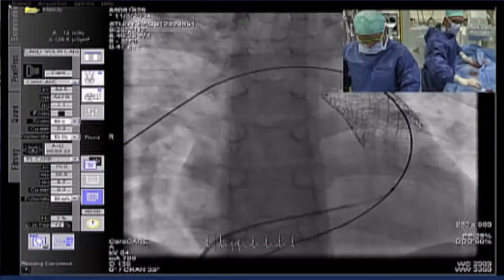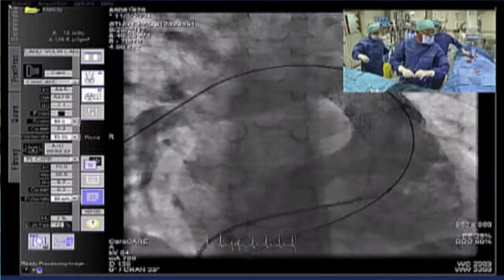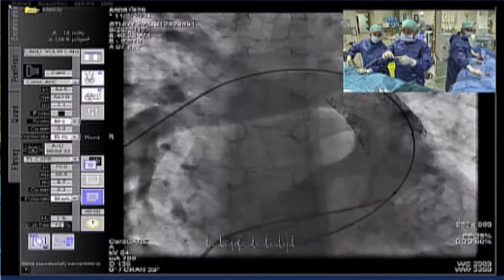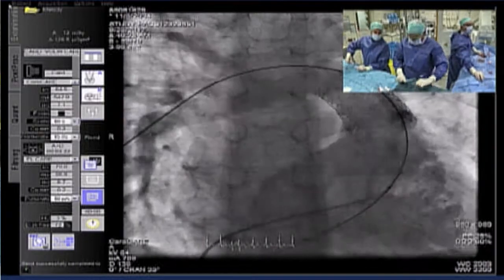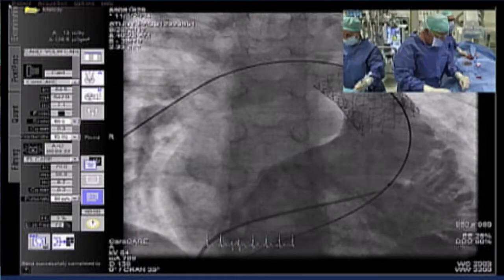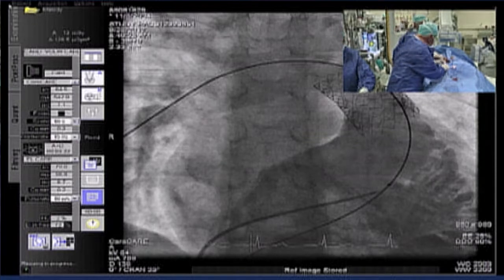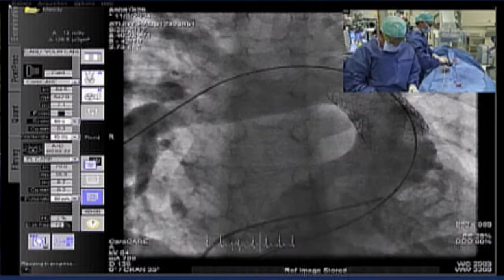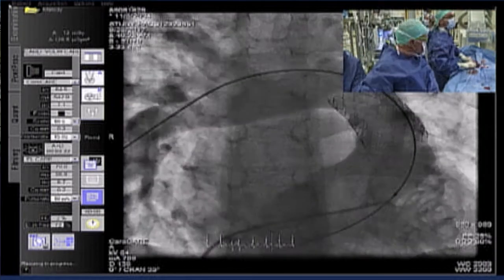Okay, Mark, we're listening. So I'm gonna try to put the stent equal to the distal half of the stent, so that the distal ends of the melody and the stent will almost superimpose. Okay, that's the aim. It's always nice to say your aim in the beginning. Okay, we go in.